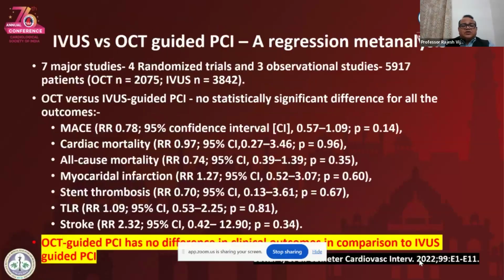And now the question comes for the left main, whether it's IVUS or OCT. Yes, IVUS has definitely shown the advantage, mortality and morbidity benefit with left main PCI for a long time, but recently there are a few studies about the role of OCT for the left main and complex lesions being supported with OCT imaging.